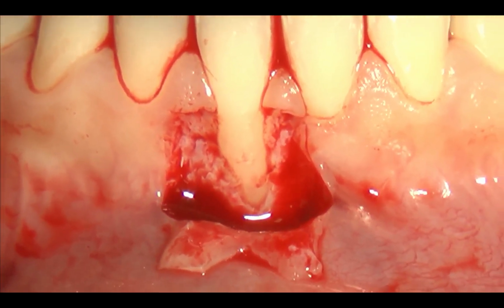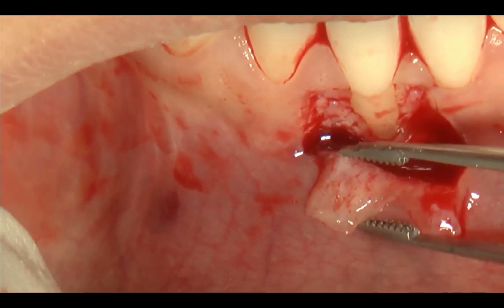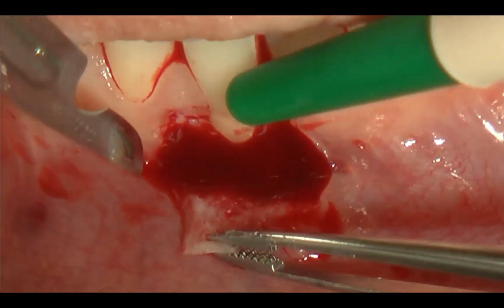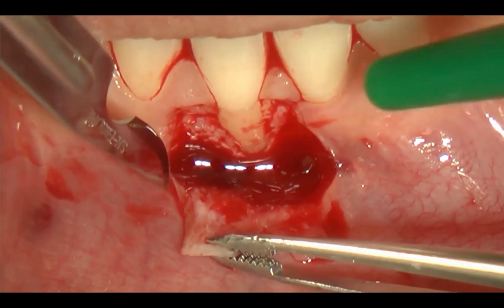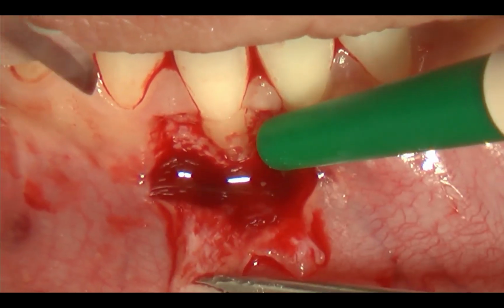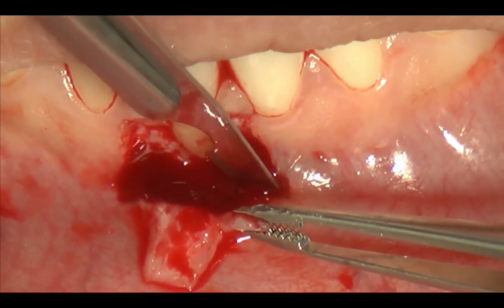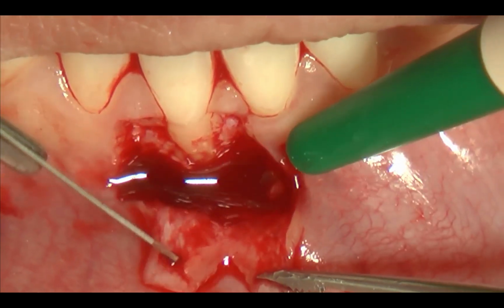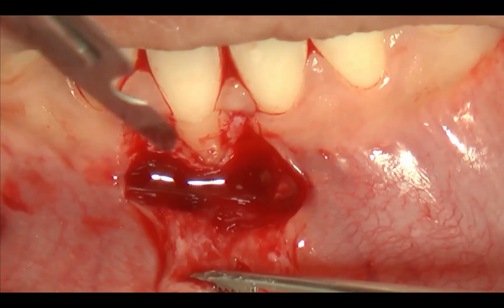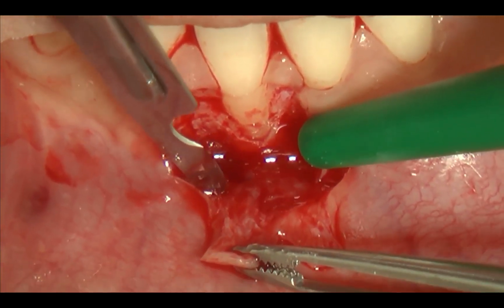Now it is important to change. So I will, you're inside, stay inside, not in front of me. I will increase a bit the length of the vertical releasing incision on one side. And on the other side, in order to see very, very well the difference between deep incision and superficial incision, okay?